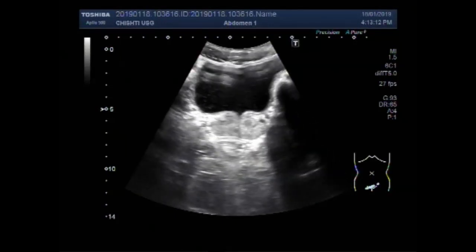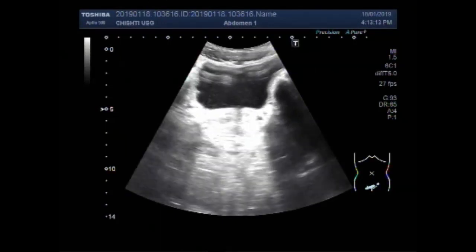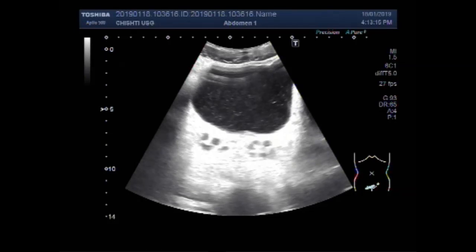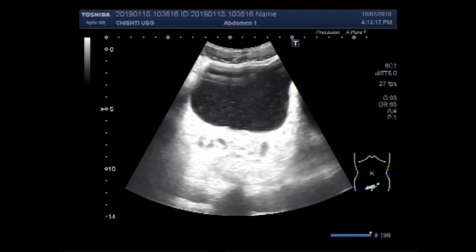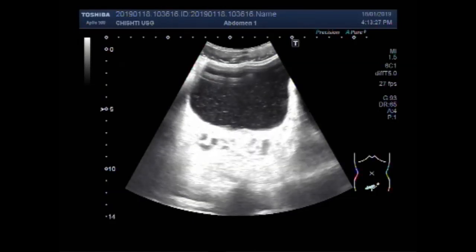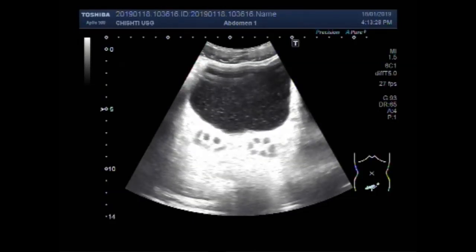Dear viewers, I hope you are all fine. This ultrasound video shows enlarged or dilated seminal vesicles with urinary tract infection. A thick sludge is seen in the urinary bladder, as you can see.